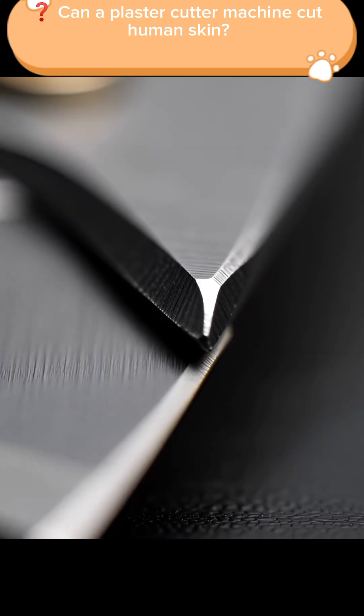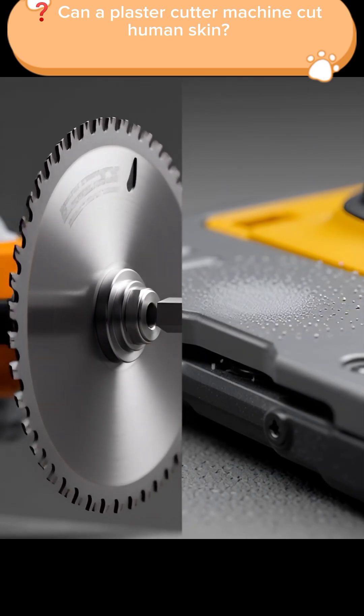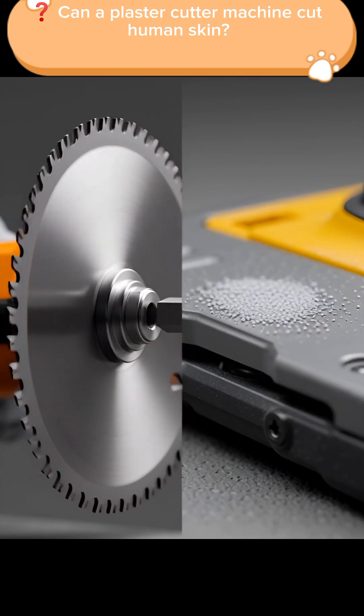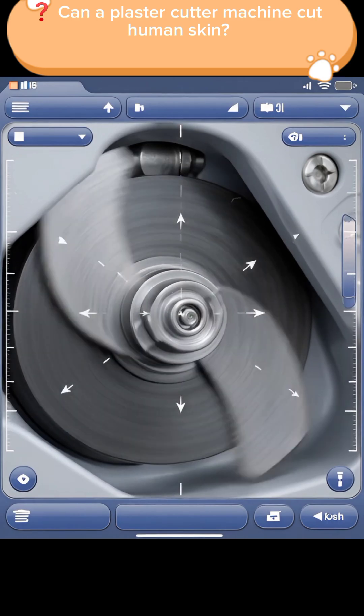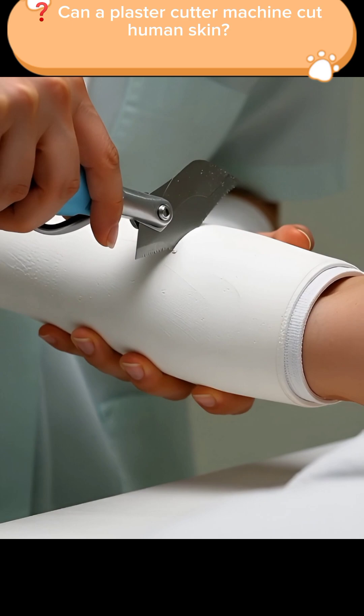Unlike other cutting tools, a plaster cutter's blade doesn't spin in circles like a saw. Instead, it vibrates at a very high speed, moving back and forth in tiny motions. Because of this vibration, the tool can easily break through hard, rigid materials like plaster.